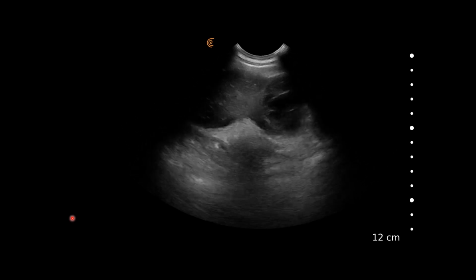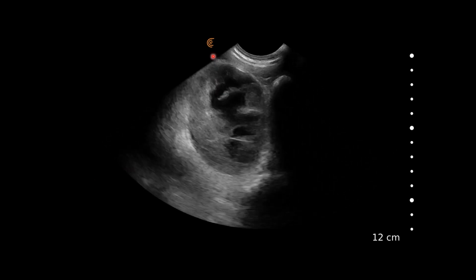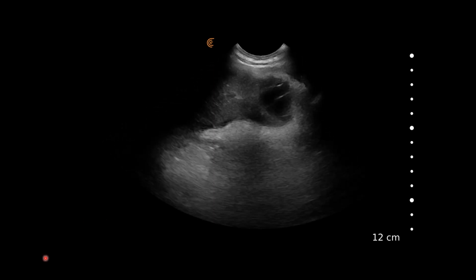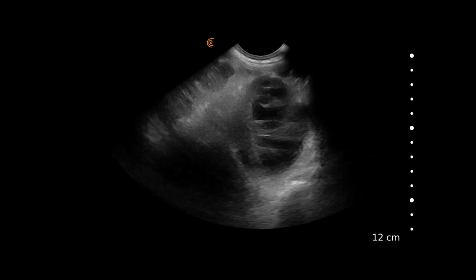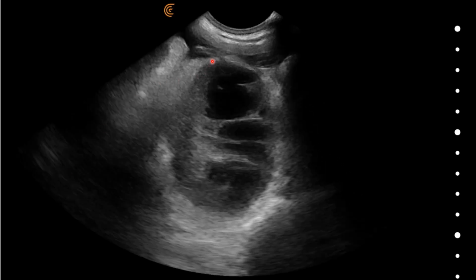Here again, a moving cine loop with the spleen and this cavitary lesion, and we can also appreciate some free fluid around the spleen in the near field. So here's the lesion again, and just to appreciate this anechoic fluid with pointy sharp edges, which tells us that it's free fluid in the abdomen surrounding the spleen, and then this hyperechoic reactive tissue around this splenic tumour.